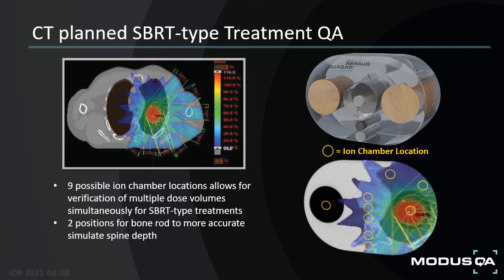For this, the phantom is being used as a patient analog, and the treatment plan can be made around it with a specific test question in mind, whether that be to verify the contour corrections, or even just the treatment of inhomogeneities during those calculations. It really does speak to the flexibility of the MP body, as it allows for multiple tests to be run on it during commissioning, and by imaging the phantom multiple times, the physicist will be able to evaluate and verify machine accuracy for each commissioned radiation beam separately.